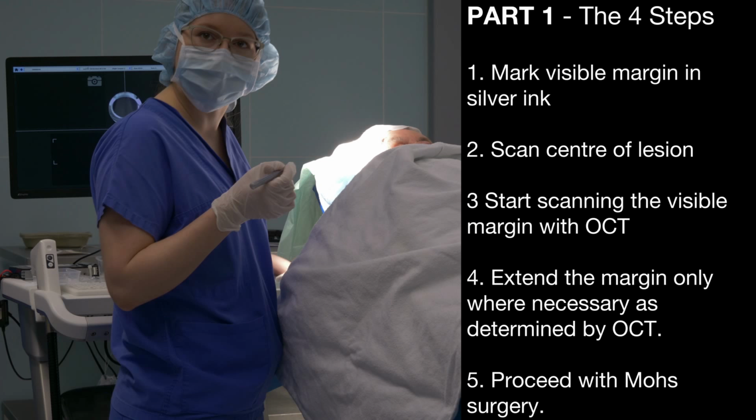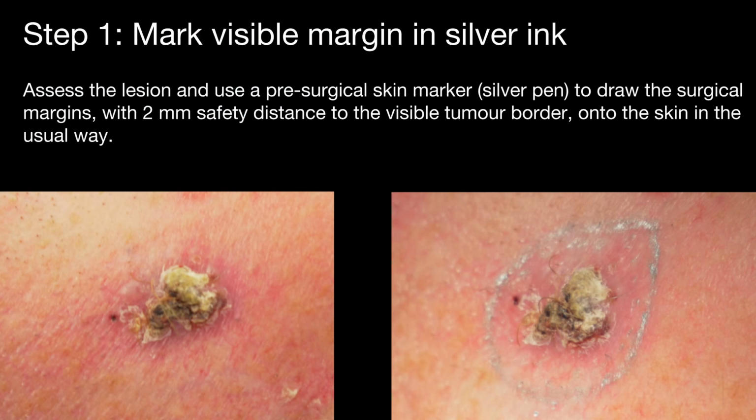So, thank you to Dr. Welzel for that introduction. We will now move on to Dr. Schuh, who will teach us the 4-step process in detail. Please note though, whilst there will be some image interpretation in this section, most will come in the second part of the video.